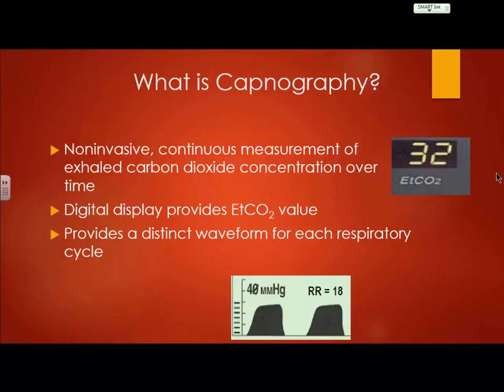Now, on the flip side of that with CO2, every time that patient expires out, whether it's from a spontaneous respiration or from a manual ventilation, we're going to read changes. We're going to read changes each time, and we're going to see trends each time. All right. So both of those are very important monitoring tools, but CO2 can give you a lot of information about what's happening post oxygen delivery. Does that make sense?